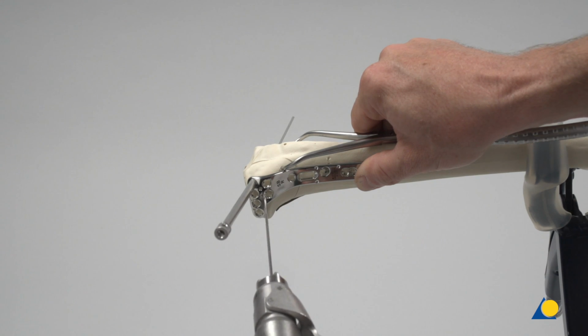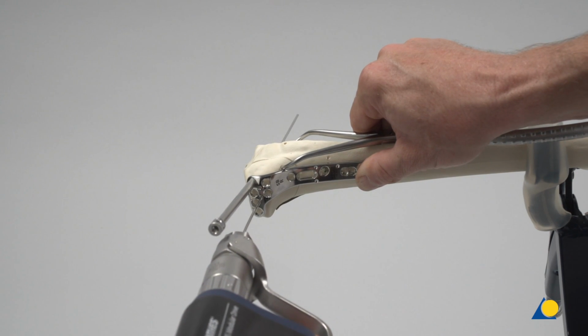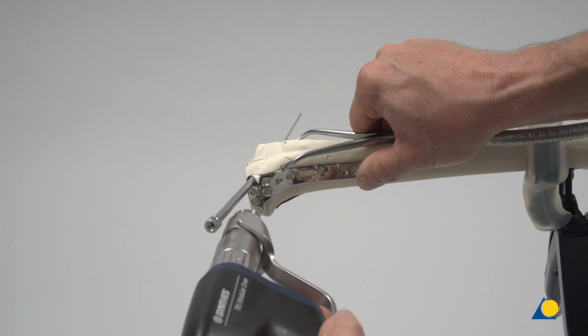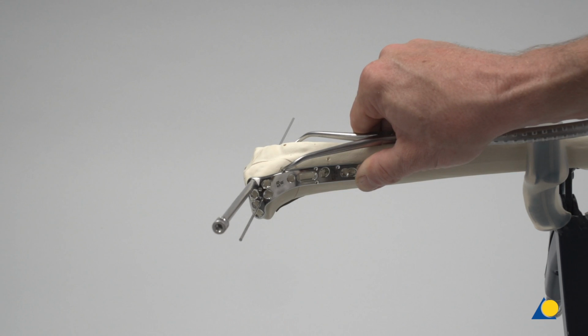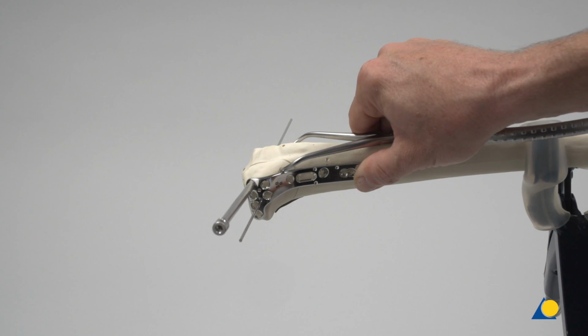In the event that the plate is not positioned correctly, the provisional proximal K-wire can be removed and the plate repositioned. In the clinical situation, image intensification in both AP and lateral planes is performed regularly to confirm the correct alignment of the plate to the tibial shaft axis and that the screw trajectories are parallel to the joint in the coronal plane. The plate screw fixation begins with the insertion of cortex screws to achieve compression of the plate to the bone, followed by the insertion of variable angle locking screws in order to lock the plate in position relative to the bone.